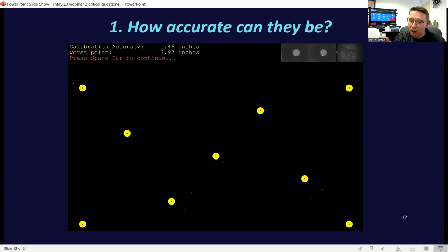And we can see up and to the left of that point some visual data, a little white cross and 2 dots. So we were wanting them to look at that icon in the bottom of the screen. However, where it tracked them actually looking was up and to the left significantly. So we can see that this person is having difficulty in the lower right-hand corner of the screen as an example, as well as a few other points as well. Numerically at the top, we see the calibration accuracy is 1.5 inches, so that's a large number. It gives us the worst point.